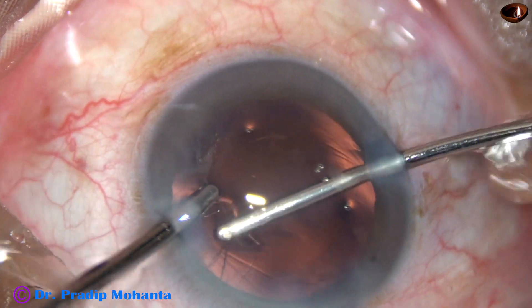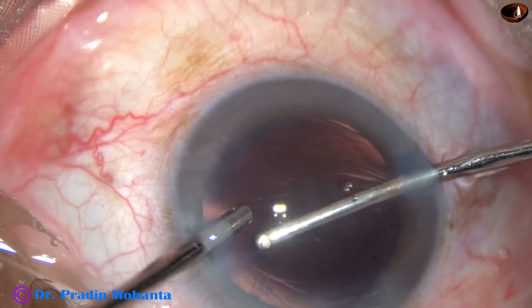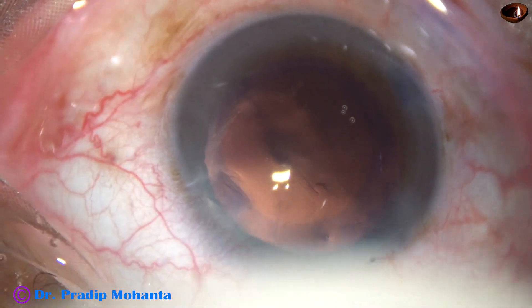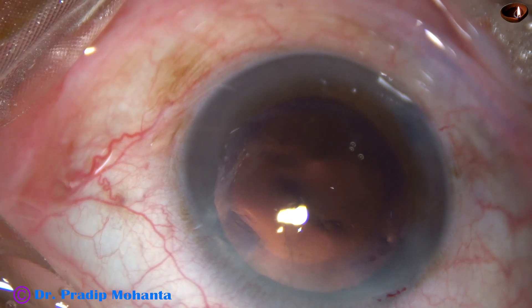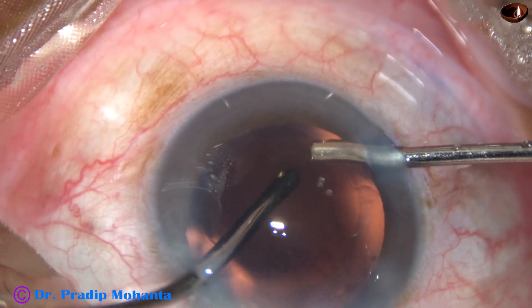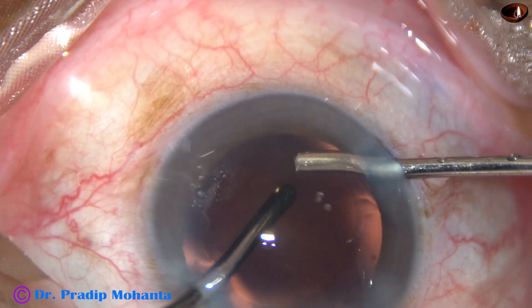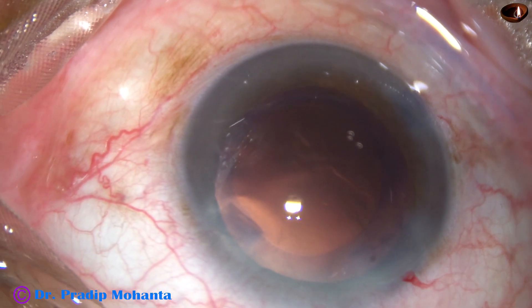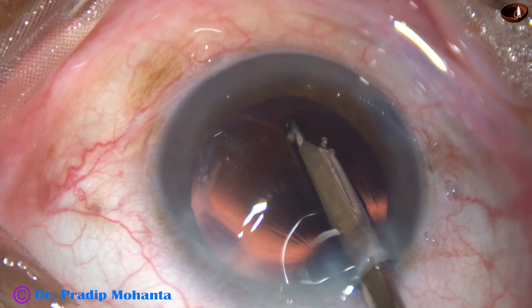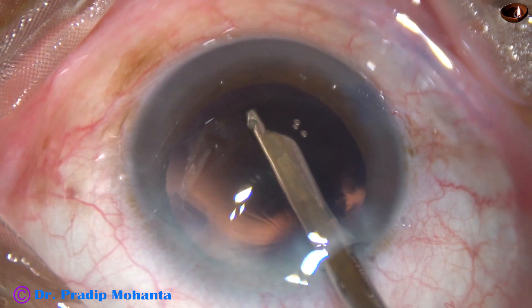The cortex is really sticky and resisting removal. There are some cells particularly near the 6 o'clock position which were attempted with cap-vac mode at vacuum around 50 and flow rate 25, but those fibres didn't come. A Simcoe cannula was used and with it those fibres sticking to the posterior capsule could be easily removed.